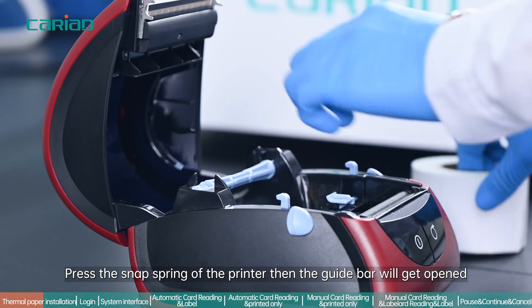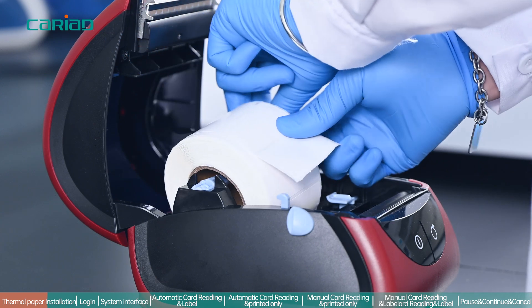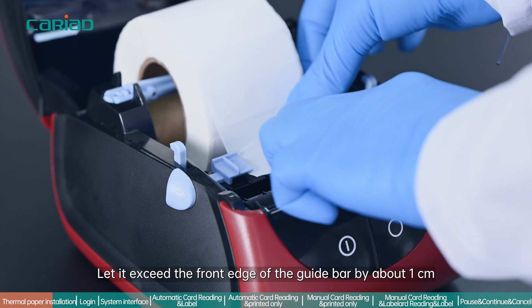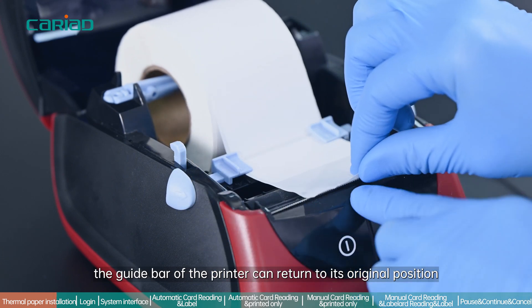For the non-standard printer, load the thermal print paper by pressing the snap spring so the guide bar opens. Place the thermal print paper on the shaft of the printer. Pass the external end of the print paper through the printer head, letting it exceed the front edge of the guide bar by about one centimeter.